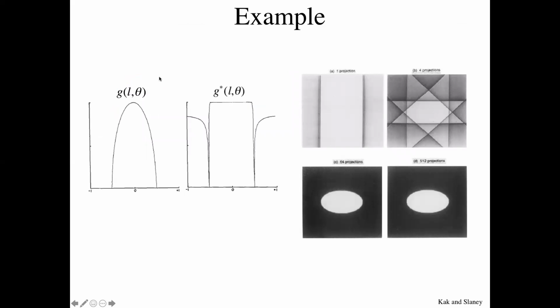So here's some examples. Again, we use these in CT as well. Here's a projection through the object. This is obviously a simple object, some kind of circular object in the middle of the field of view. And when we back projected these, remember we got a bright middle part, but then we got stuff in the background, because it was projecting it all the way through the background.